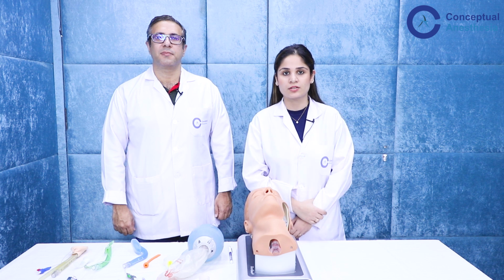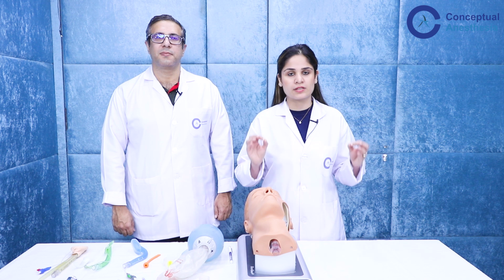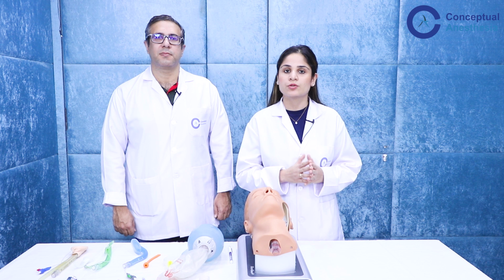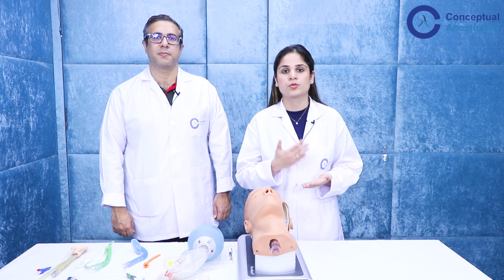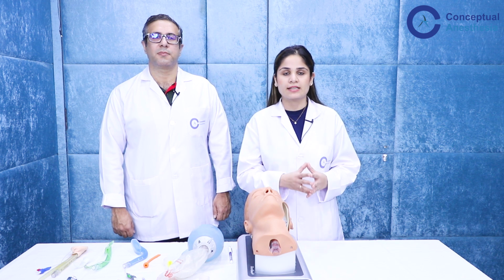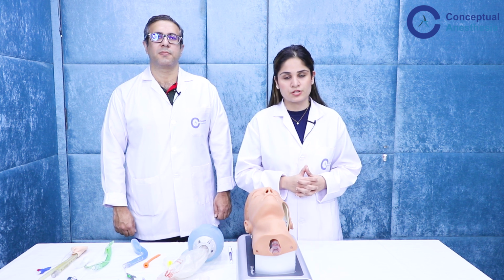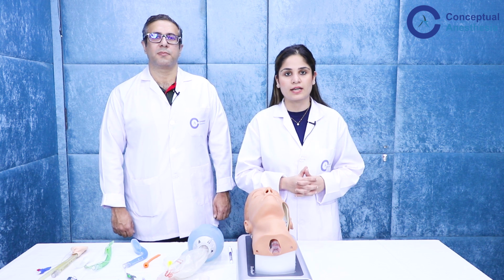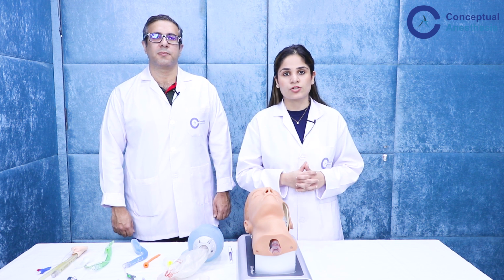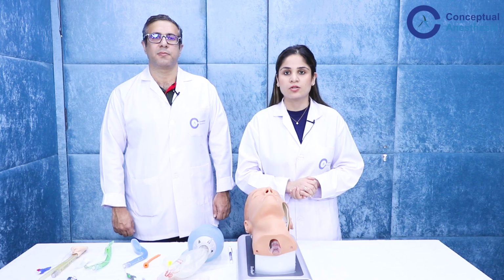Today we are going to be showing you different methods of securing the airway in a patient. Now why is it important to learn this? As anesthetists, we have to make sure that throughout the procedure of the surgery, our patient should not become hypoxic at any time. So we use different devices like endotracheal tubes, supraglottic airway devices and oro and nasopharyngeal airways that ventilate and oxygenate our patient. Now this is not important just in the operation theatre but also in the intensive care unit. So it becomes absolutely necessary for you to know how to secure the airway with all the devices that we have here today. So let's have a look at them.